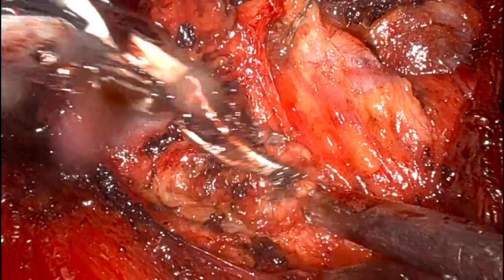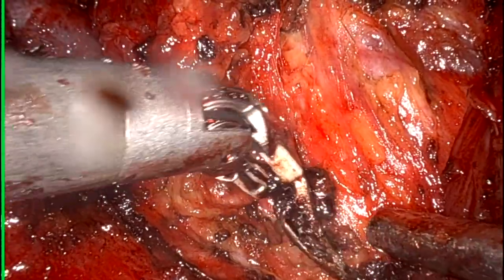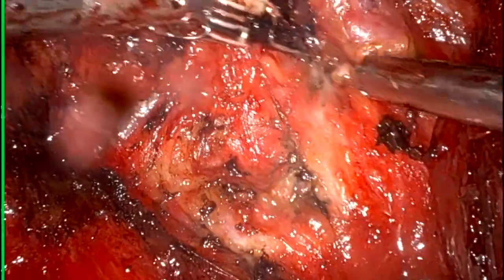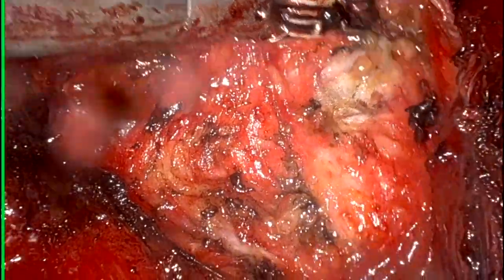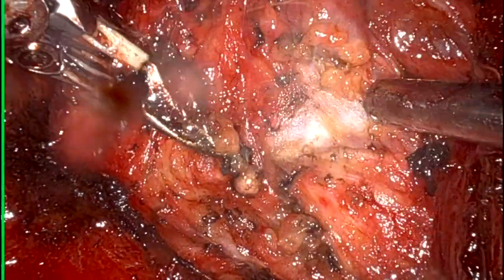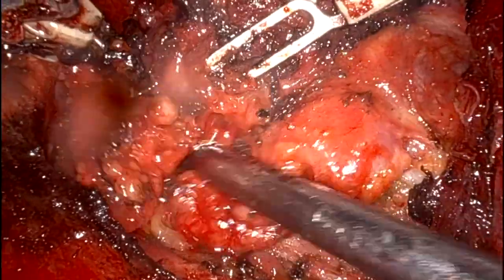Can you see a node just sitting over internal jugular vein? So at my center, we call it Purvi's node. Dr. Purvi is my colleague and she's an excellent person, excellent surgeon and extremely brave lady. While teaching me neck dissection, she used to say there is a node you will always find at level 3 just sitting over internal jugular vein. So we used to call it Purvi's node.